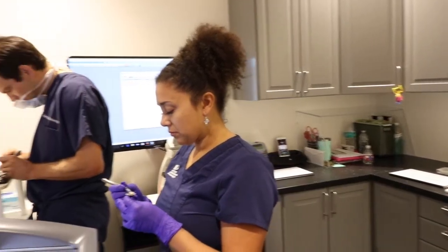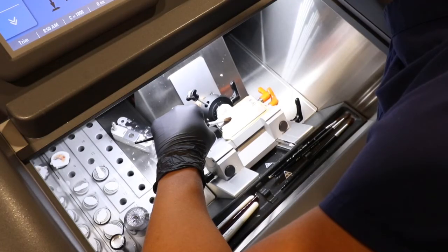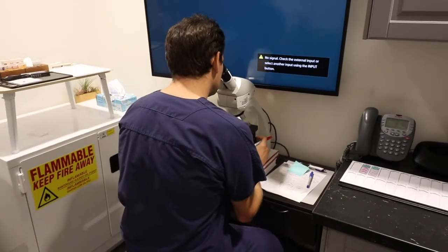The tissue is then given to my histotech who freezes the tissue, cuts it in very small micrometer size pieces, and then it is stained for me to see under the microscope.